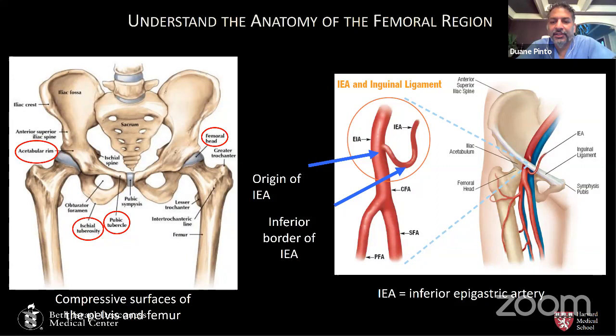We often will take a picture and say, hey, yeah, that looks pretty good. It's right near the inferior epigastric. It must be outside of the retroperitoneum. Actually, you can be, as in this cartoon, just below the inferior epigastric and be in the retroperitoneum. So remember, you're looking for that lower portion of the inferior epigastric. So I think this is why it's important also when you first get your micropuncture in and the wire and you put your dilator in to take a picture. Because before you have placed your large bore sheath, you can define whether you're in an area that you're happy with.